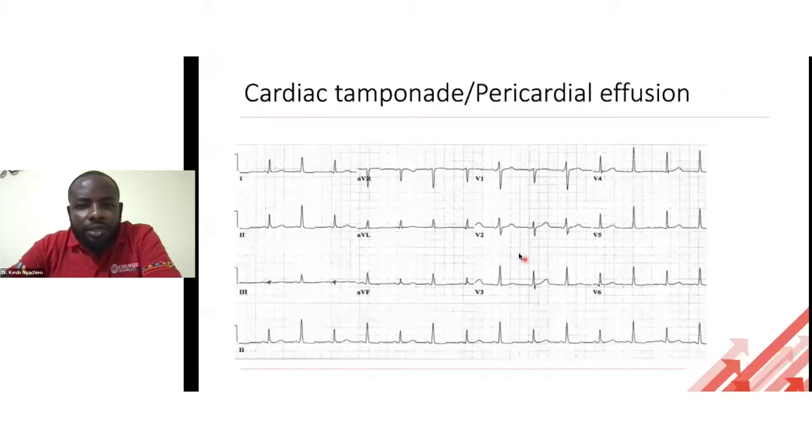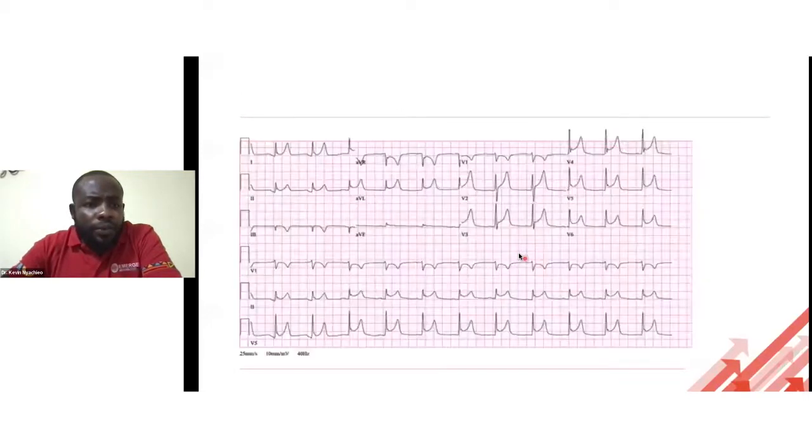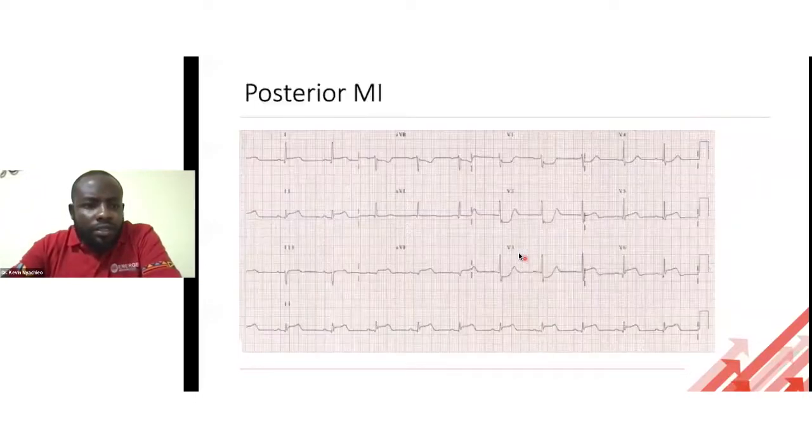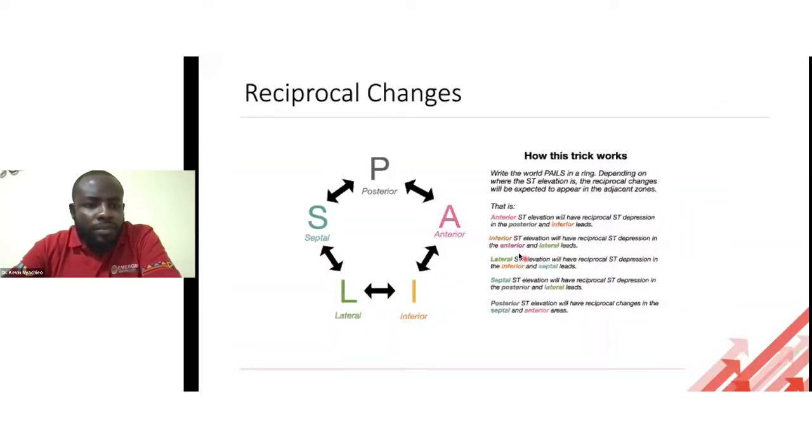But in summary, my talk today was to be able to talk about chest pain ECGs. In addition to just knowing how ECG looks, in addition to being able to identify the pattern, it's a good idea to be able to classify your patient, see how your patient is presenting, what are the risk factors, what type of pain. The SOCRATES is quite important to be able to classify typical versus atypical chest pain. The way your patient is presenting, their history, their family history is quite significant. So you have all of these things at the back of your mind.